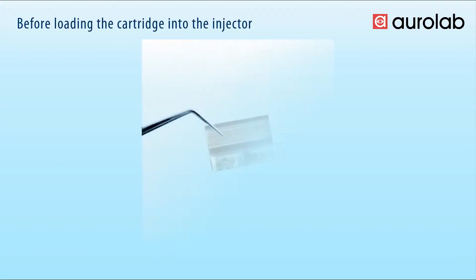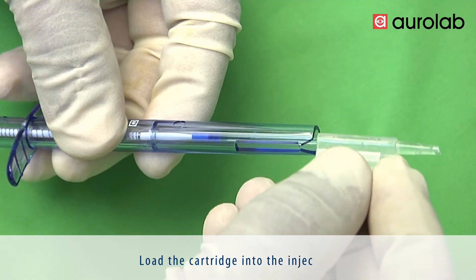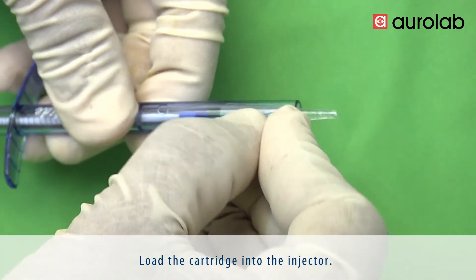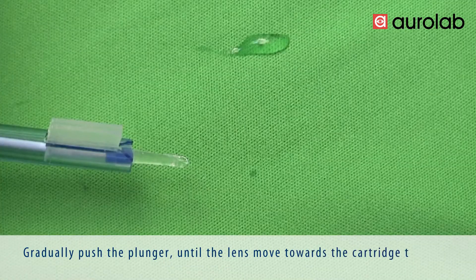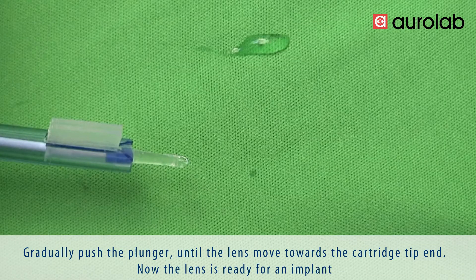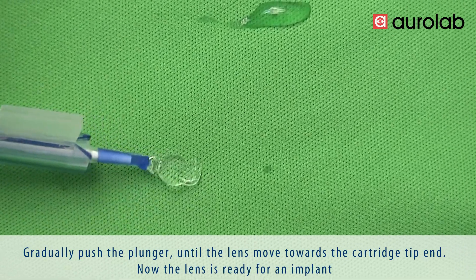Before loading the cartridge into the injector, ensure both the haptics and optic are completely inside the cartridge. Load the cartridge into the injector and gradually push the plunger until the lens moves towards the cartridge tip end. The lens is now ready for implant.